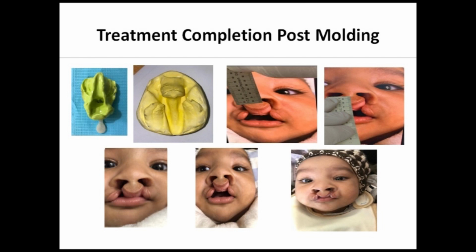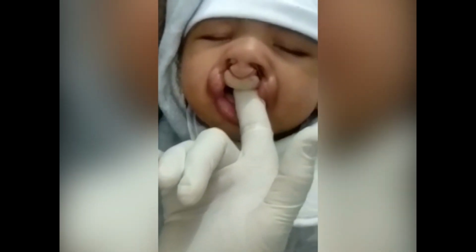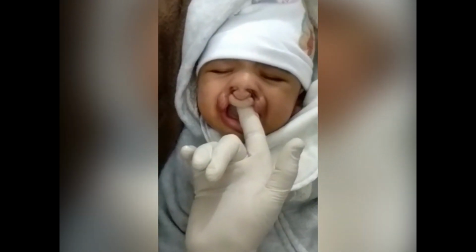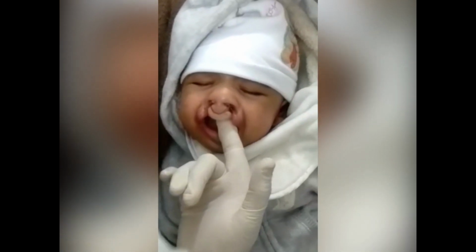The palatal plate serves as an obturator, facilitating the function of bottle suction and swallow. Distinctive feature of the palatal plate is that it makes the appliance self-retentive and independent of extraoral means of retention. On insertion, the activated self-retentive ring plate exerts static distal and downward force on the premaxillary segment. Moreover, dynamic forces from the orofacial muscles during function of bottle suction and swallowing and distally directed forces from the tongue muscles may enhance the action of the self-retentive device.